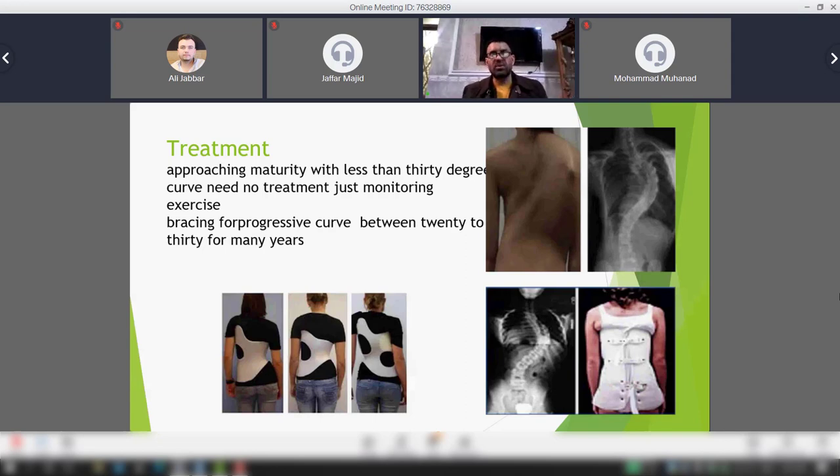يعني شنو Cobb's angle؟ من يجي المريض بهالطريق اول مره نشوف عمره ايش قد عمره. العمر هذا اللي تحكي، طبعا اكو شيء اسمه chronological age او what's near to the biological، واكو real age. يعني يجي المريض يقول لك اني عمري 10 سنين، نجي نعرف هذا it is reliable to the chronological age or not. ناخذ اشعه للحوض نشوف الماتوريتي مالته. اكو ساين اسمها Risser sign.